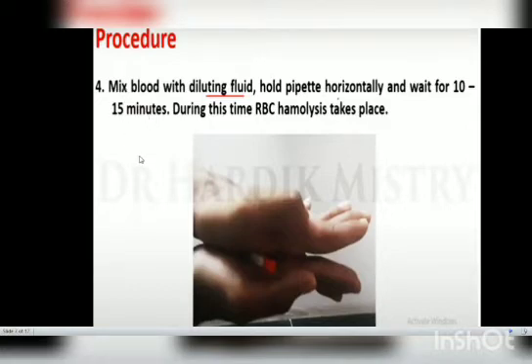Next, mix the blood with the diluting fluid by holding the pipette horizontally and waiting for 10 to 15 minutes. During this process, hemolysis takes place — that is where the RBCs break down.